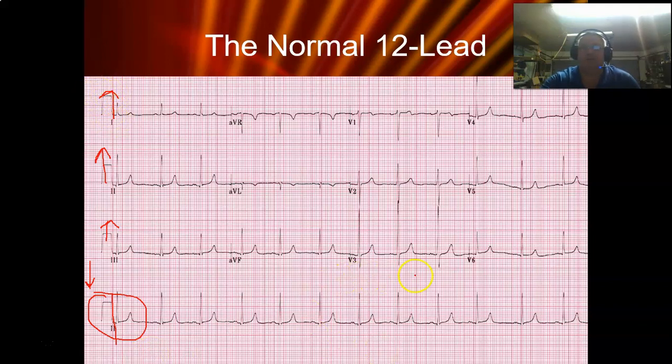And by the way, this is a sinus rhythm. As I'm looking at this 12 lead, I'm looking at these 12 up here. Now, there are some 12 leads that may have 3 strips down here. Take a look here, because this correlates with the machine and what it's taking. But these first three rows up here are my diagnostic rows. If I'm looking at the actual strip, I'm looking at it down here.